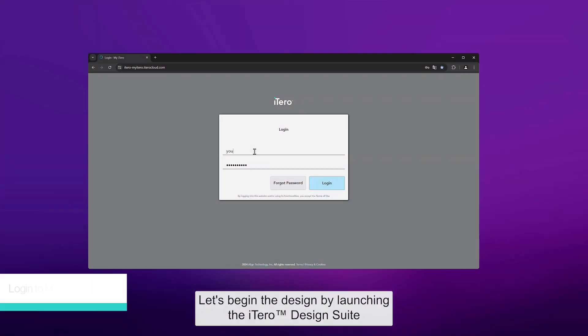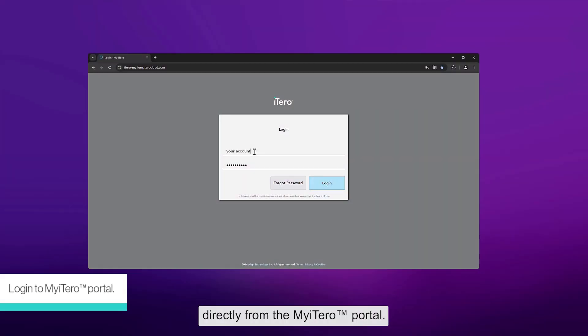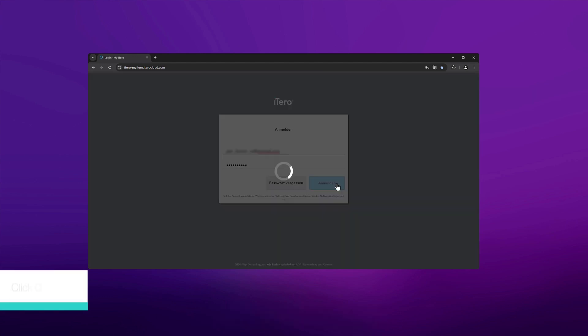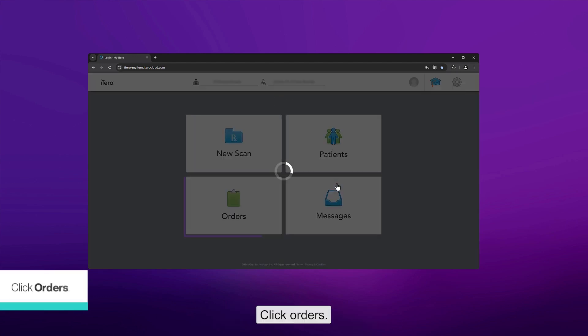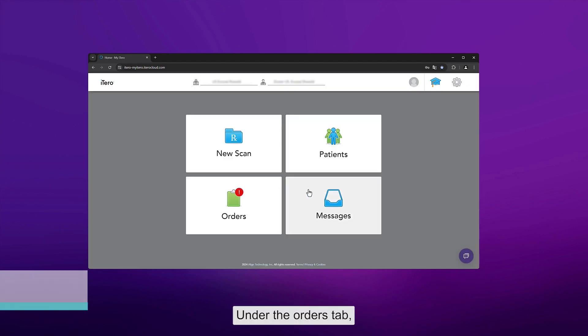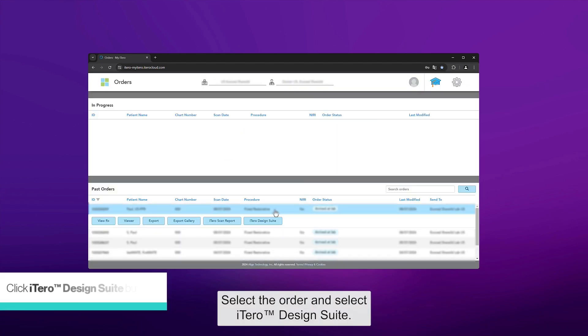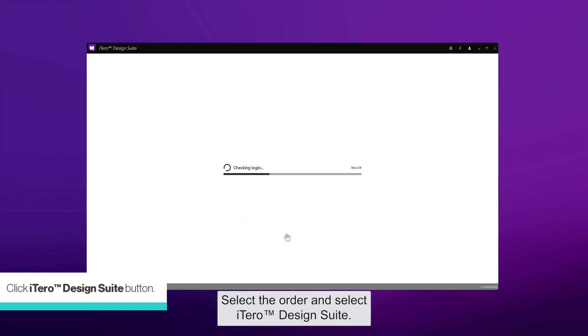Let's begin the design by launching the iTero Design Suite directly from the My iTero Portal. Click Orders. Under the Orders tab, select the Order and select iTero Design Suite.